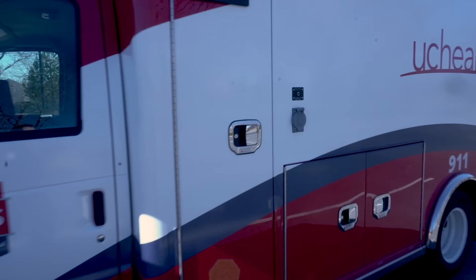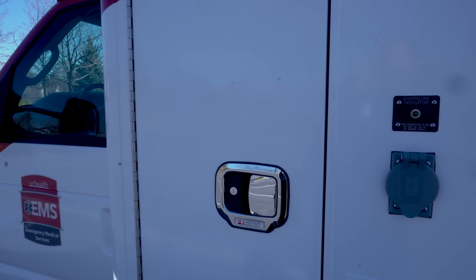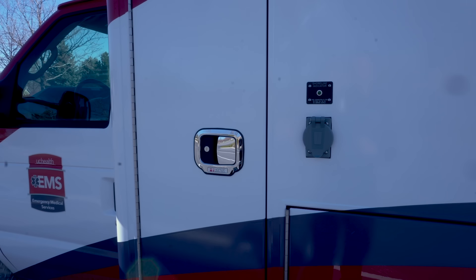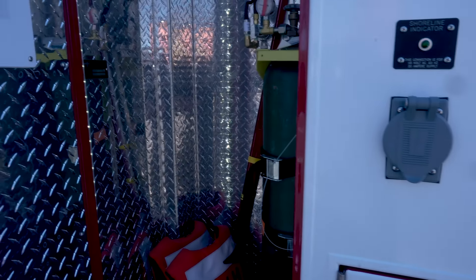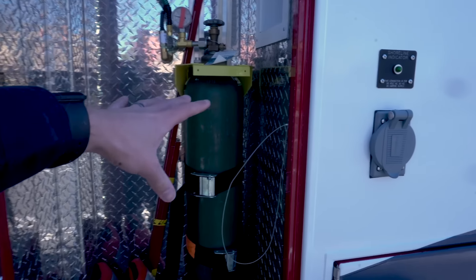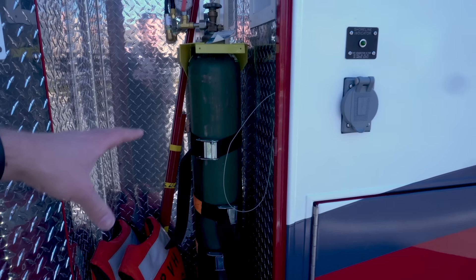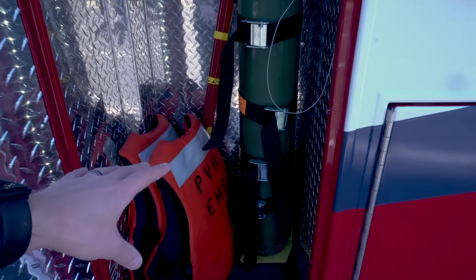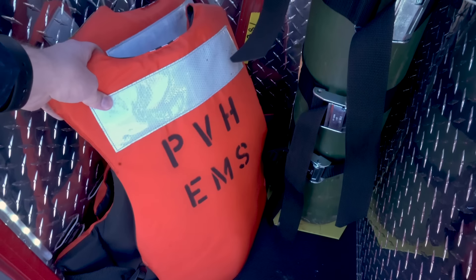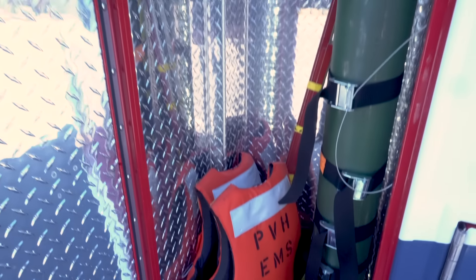Coming over here to the driver's side cabinet, up here we have the placard that shows what unit we're in — it just identifies the rigs. We have about 30 to 40 rigs on the road at any given time, so those are identifiers. Coming into this cabinet, we have a large inline O2 tank which supplies the entire ambulance with oxygen and lasts for quite a while, even with continuous CPAP. Down here, we've got two life preservers — we've got a lot of water in our territory, so we use these, but if we need them, they're there.